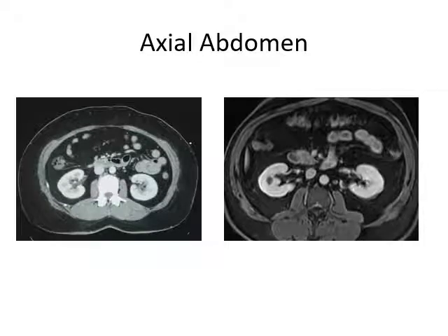Here's the abdomen, a different kind of cut as well. This one's a little bit further up, I believe. We've got our kidneys here in the MRI. We've got some bowels here, and some little bowels there as well. You can see the vertebrae here, in a different color. You can see muscle back here. These are the muscles that line the spine to keep you upright. Right here in the center is your spinal cord. Again, it's just getting used to looking at these pictures.